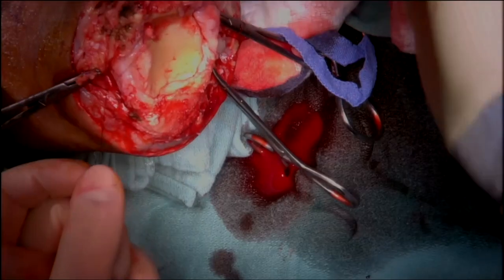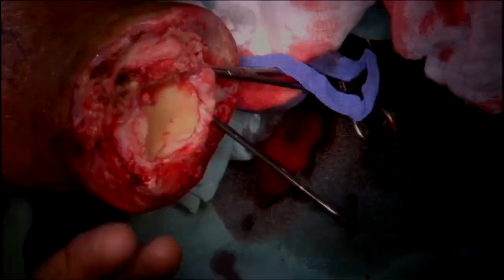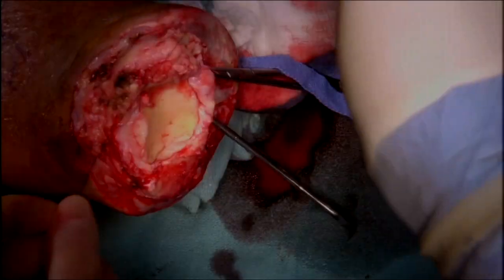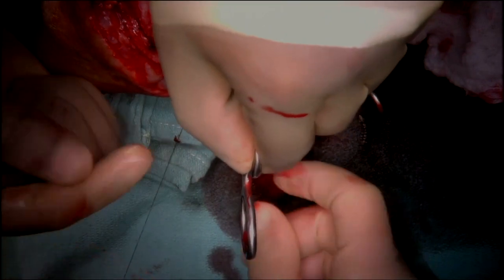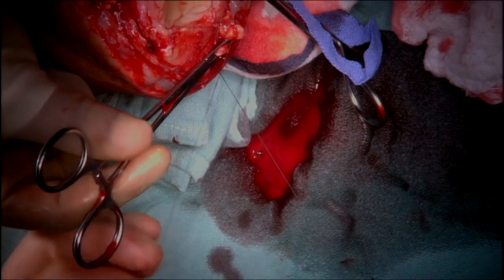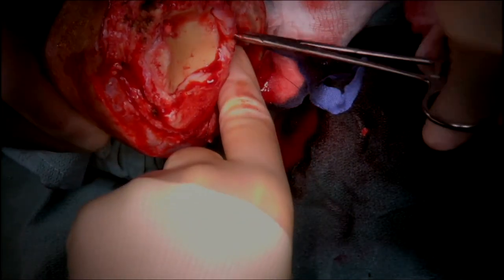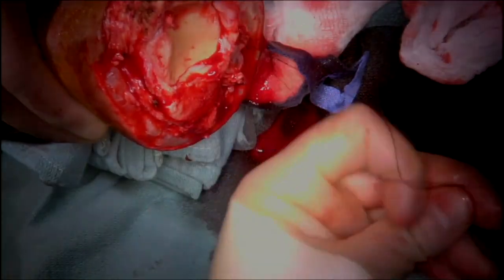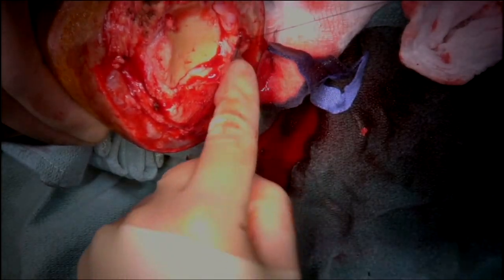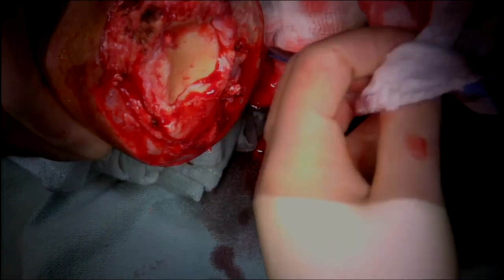Subsequently, the anterior tibial artery, the posterior tibial artery, and peroneal artery are tied off with three o-silk sutures. Additionally, the great saphenous and small saphenous veins are ligated and over-sewn as needed.